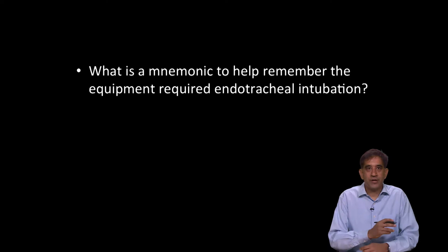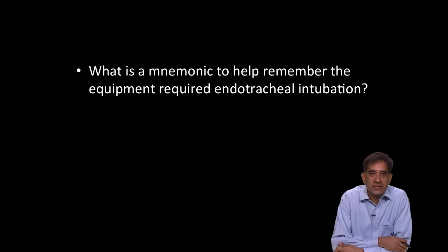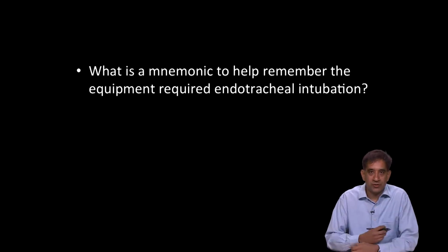All right, so Carter has been asked to intubate this patient. What is a mnemonic to help remember the equipment that you need prior to endotracheal intubation? So our first question is, what is the mnemonic for the equipment that you need to perform endotracheal intubation?